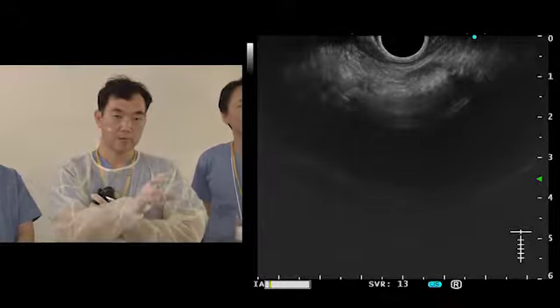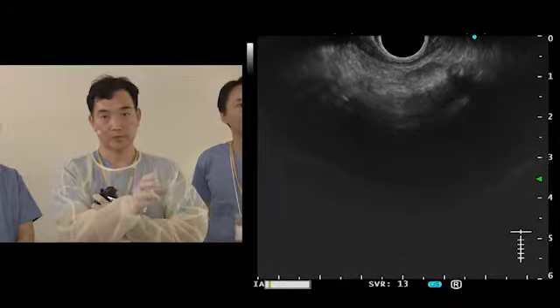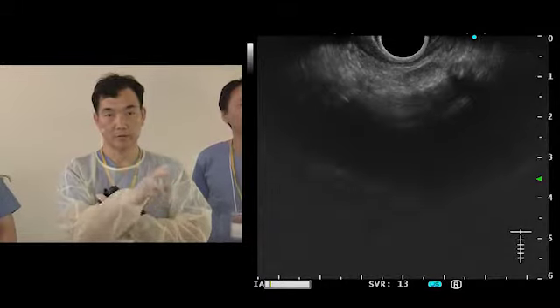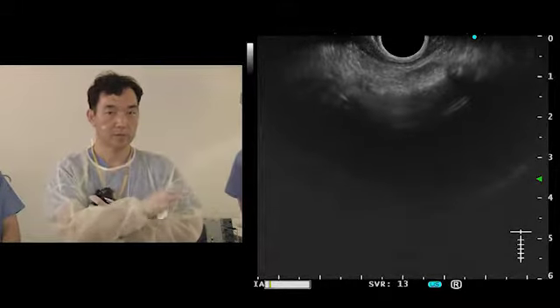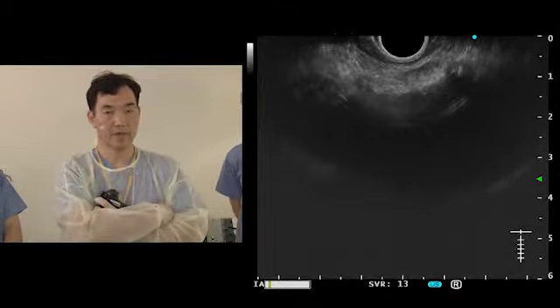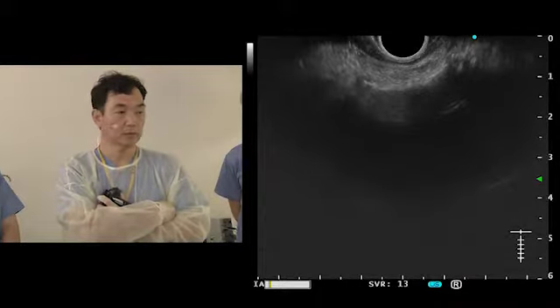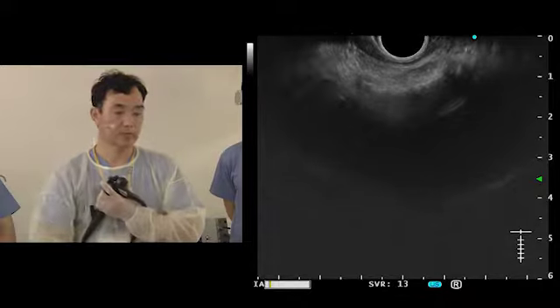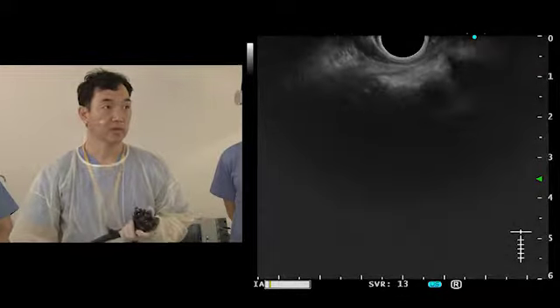The appearance was rather small, but as you noticed on the CAT scan, it was a much bigger appearance. The enhancement was moderate. It was not a hyper-enhanced nodule. So the main question is to identify the nature of this tumor.